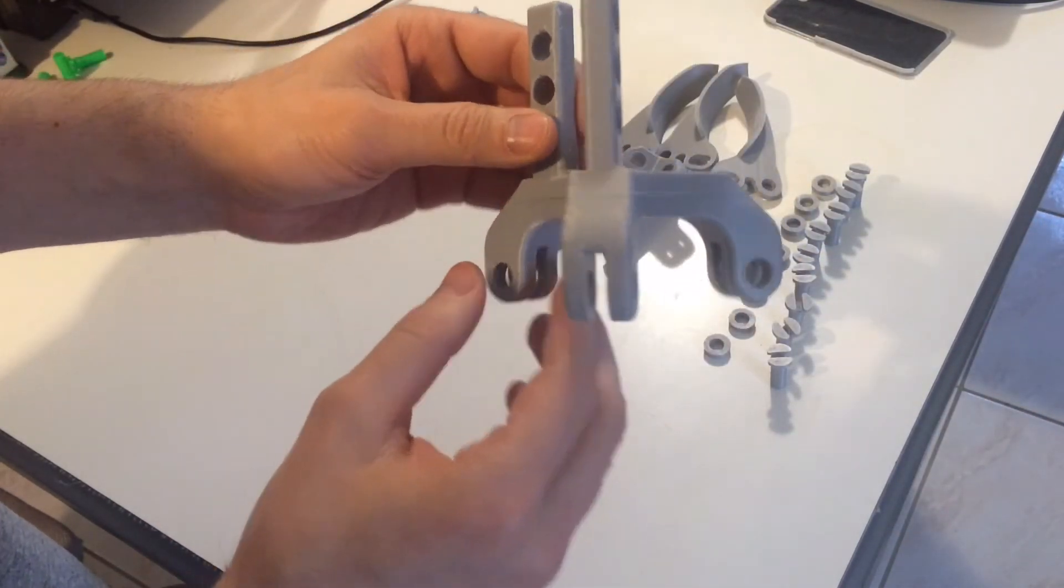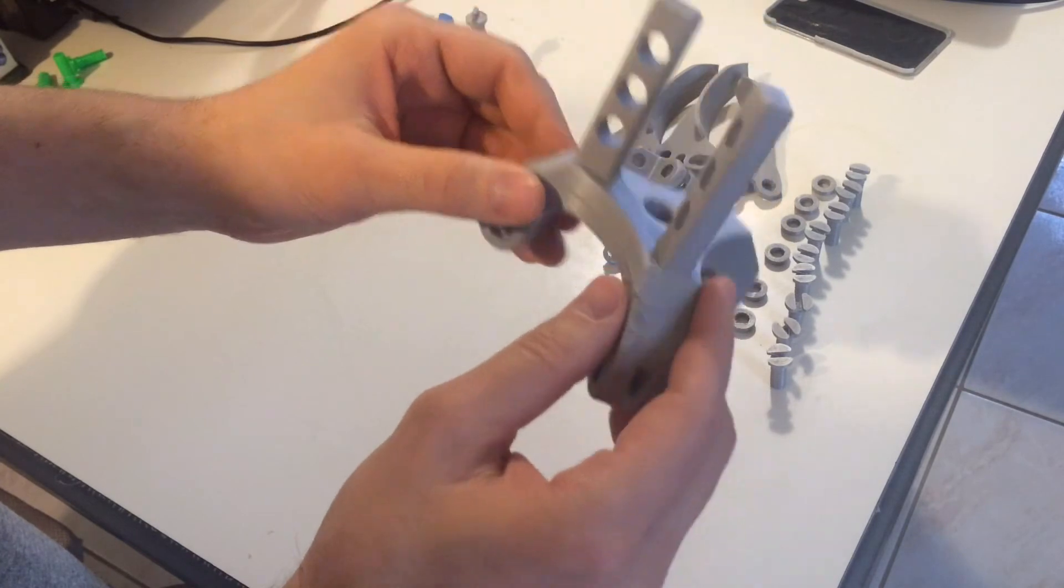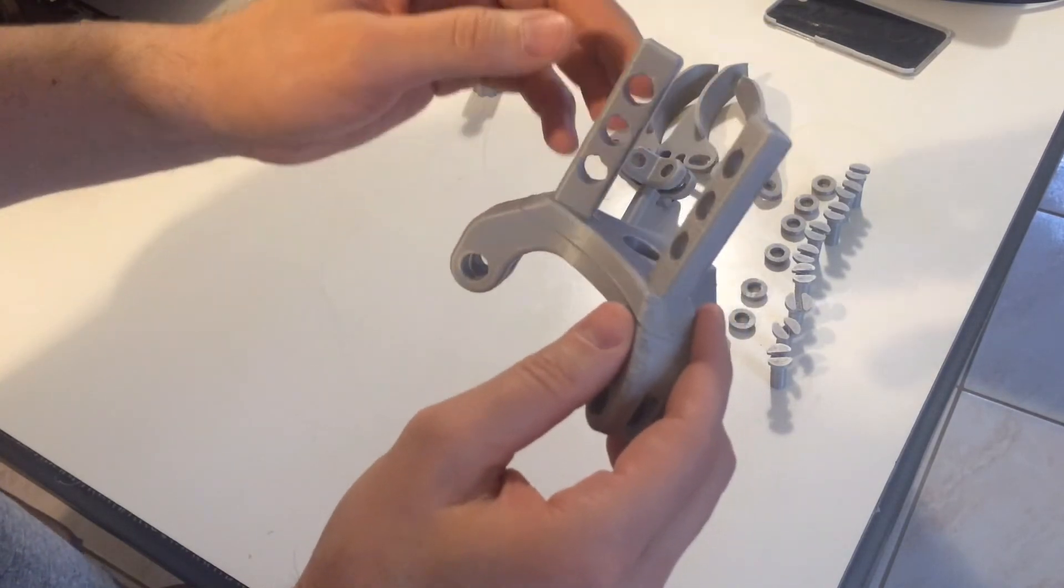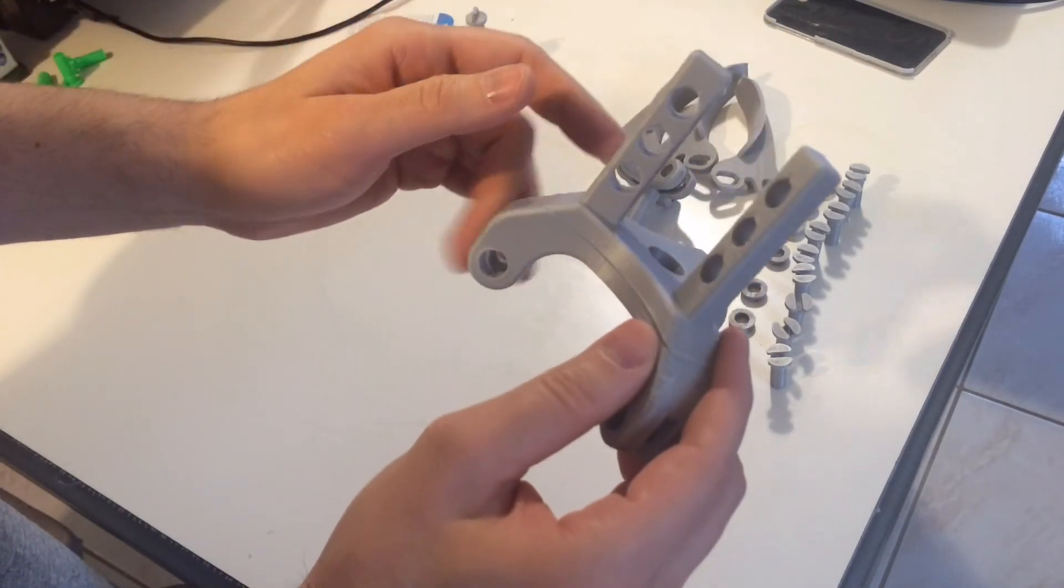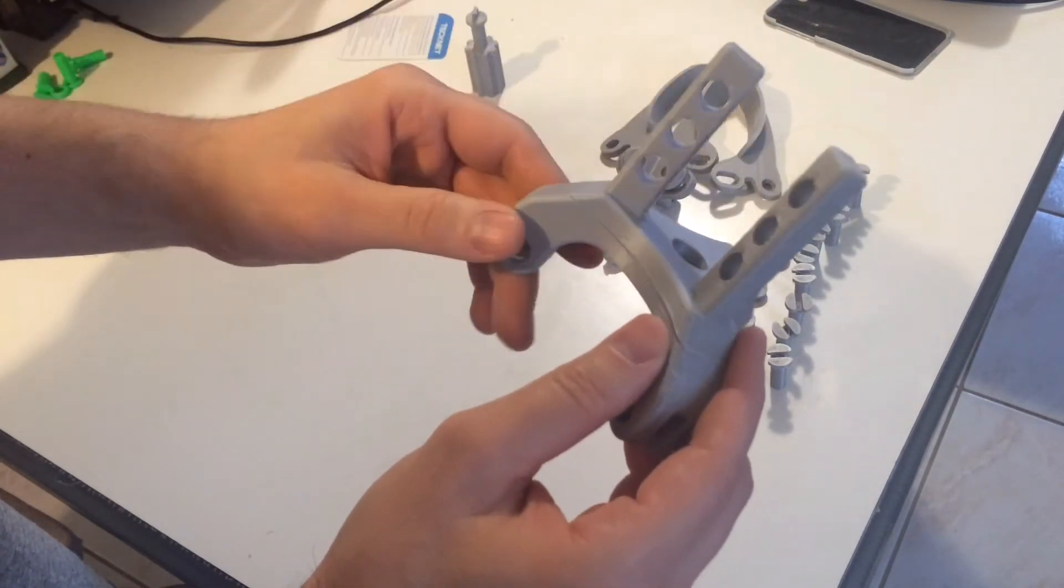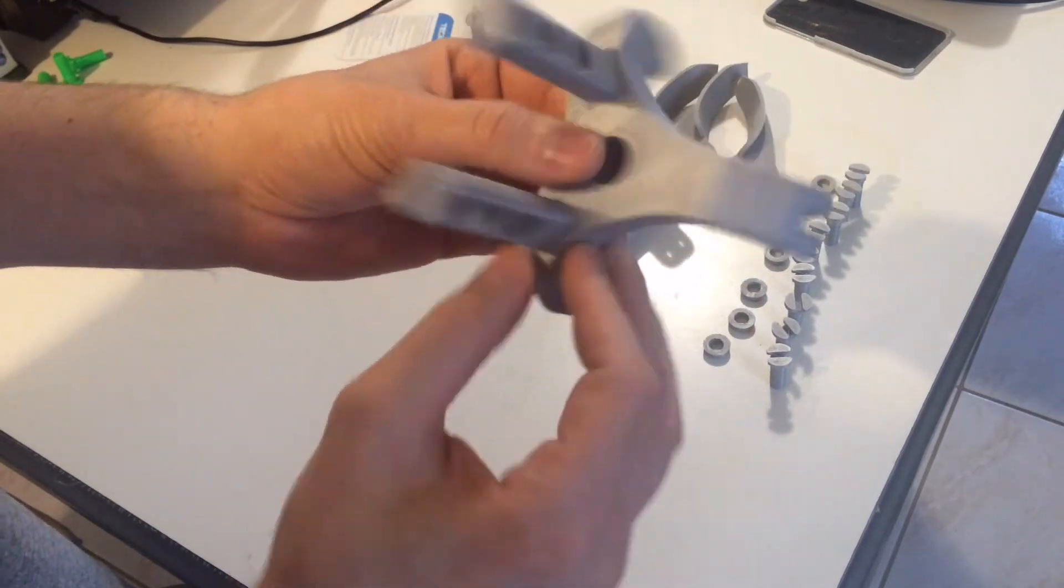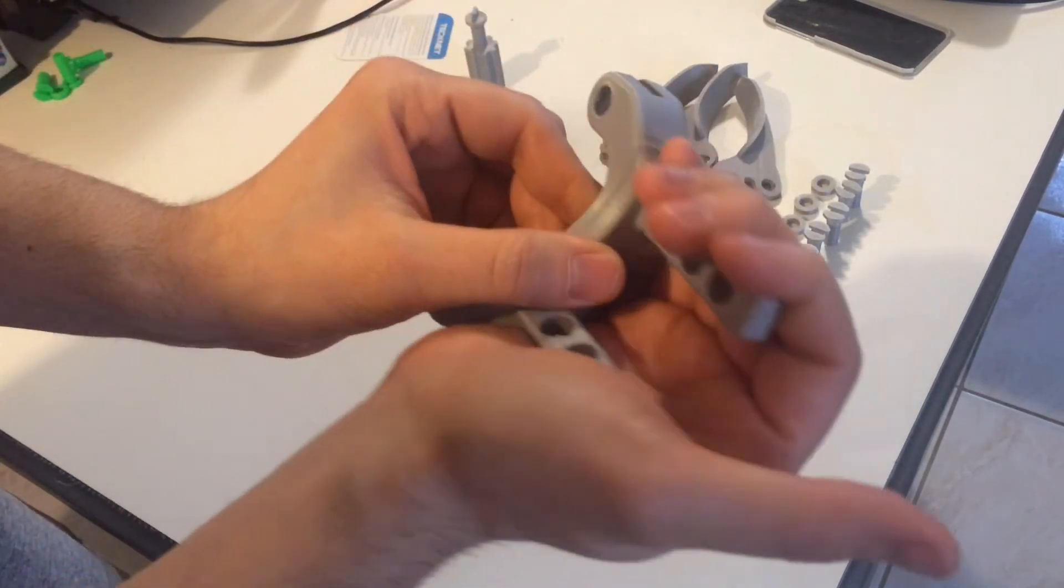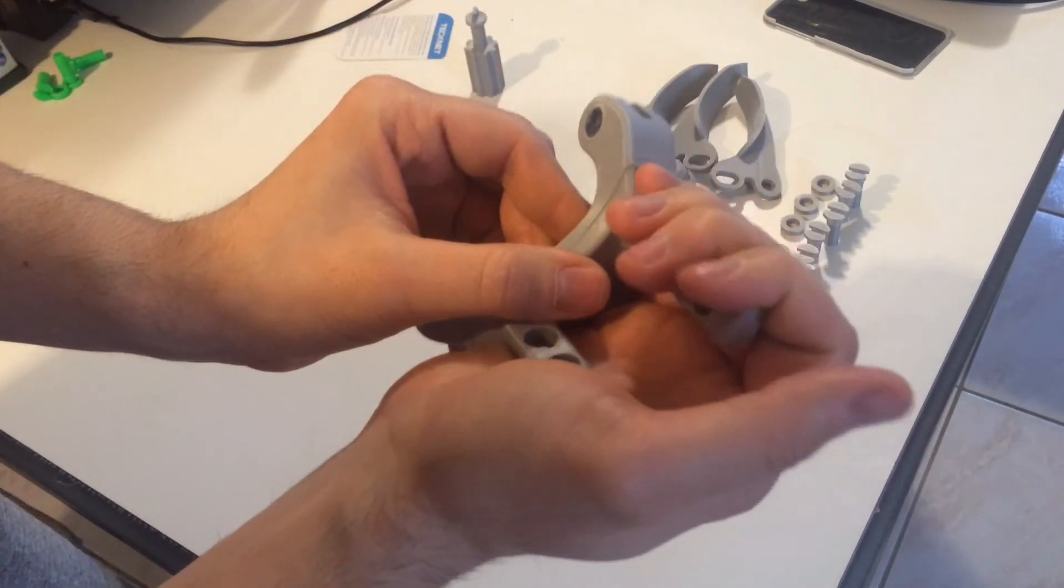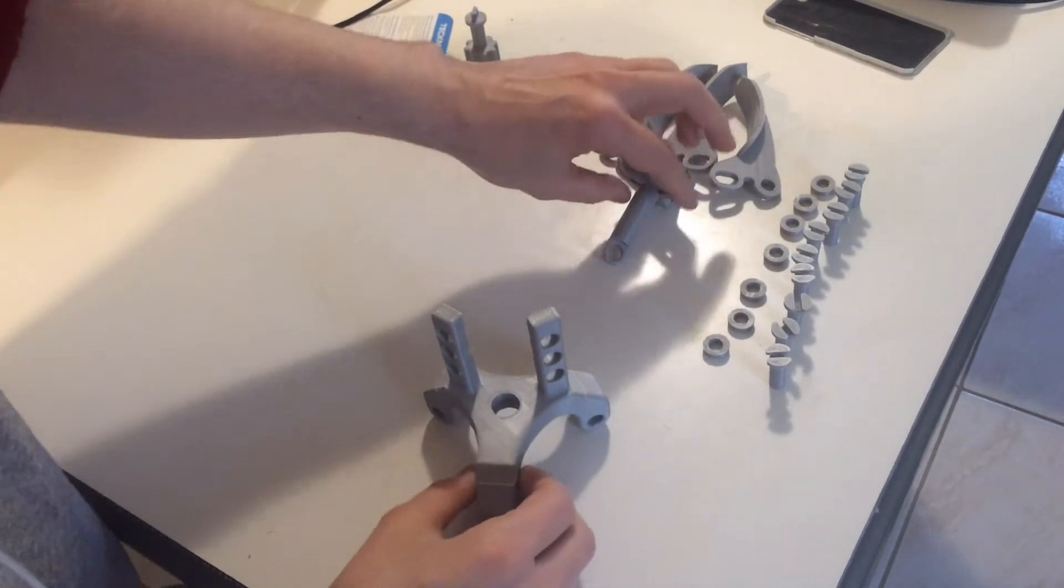As for layering and stuff, I did two perimeters. For the most part it was three top layers and between two and three bottom layers, and nothing more than five percent infill. And trust me, this ain't gonna snap unless you really snap it.